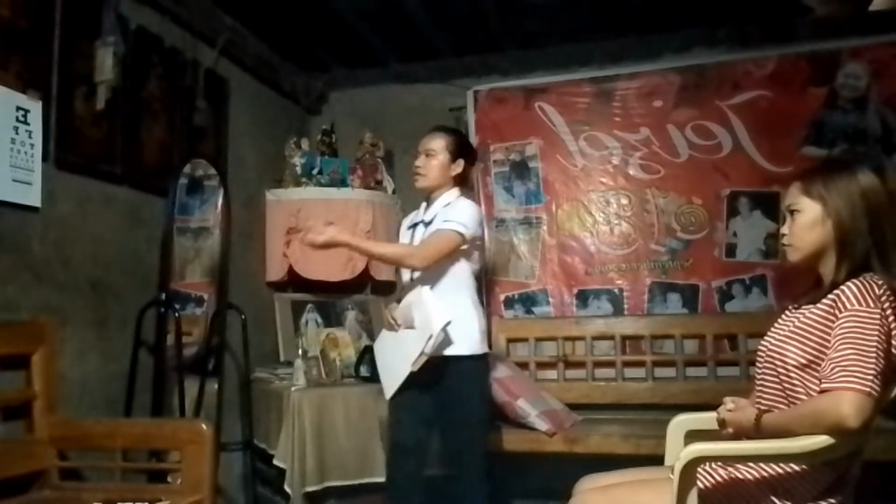So we have to get the client to stand or be seated 20 feet apart from the Snellen chart, with the eye not being tested covered, and ask her to read each line until she cannot decipher the letters. Also, we need to take 3 readings: the right eye, left, and both eyes. And also, we need to record the readings of each eye and both eyes. So, okay. So, ma'am, can you read for me with both eyes?